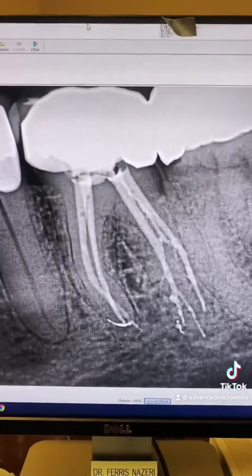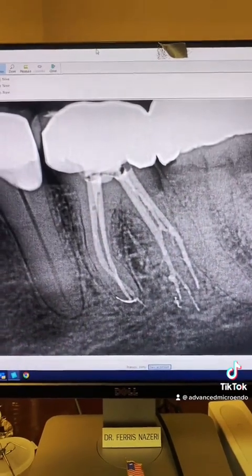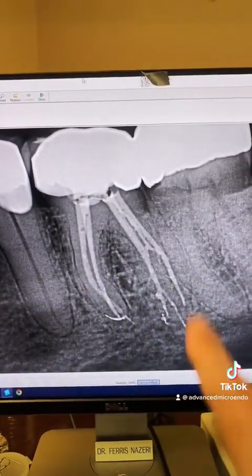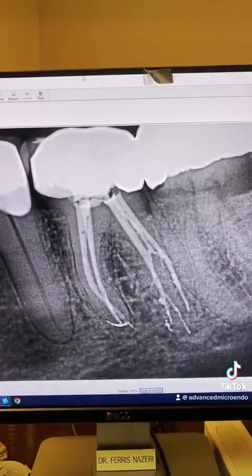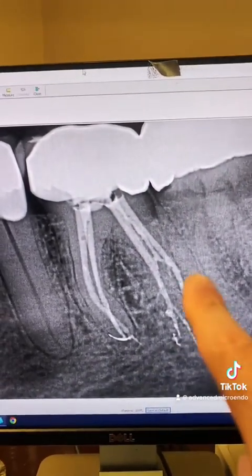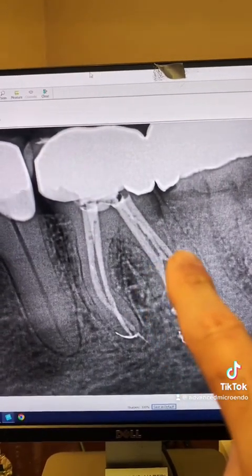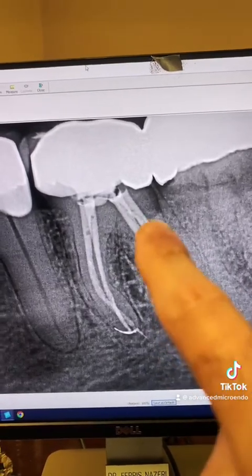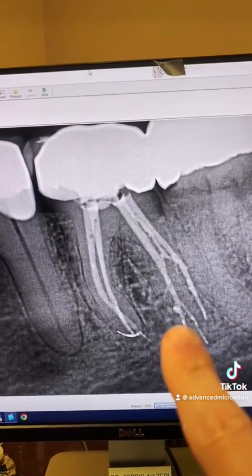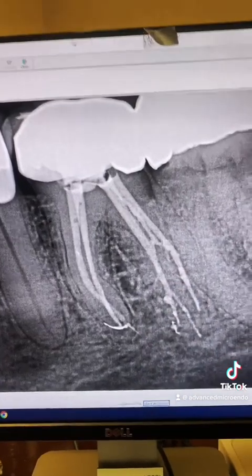Here's the post-op. Take a look at all of this anatomy that we were able to pick up. Two mesial canals. Look at the distal root and look at the anatomy of the distal root. Look at the anastomosis between the distal buccal and distal lingual canals. All of that there. And then the distal lingual bifurcates in the apical few millimeters.